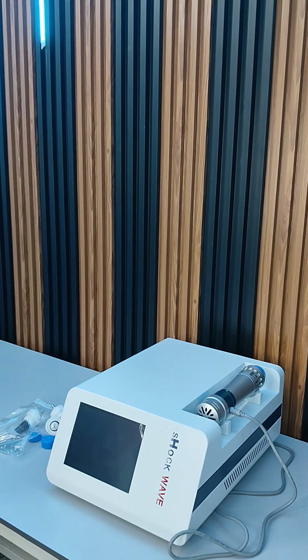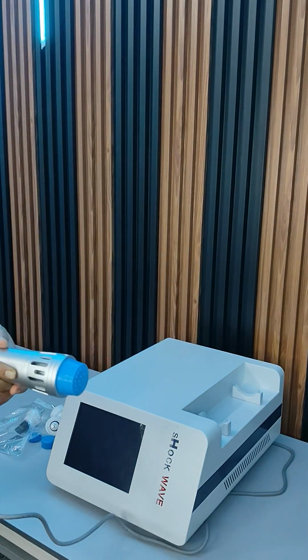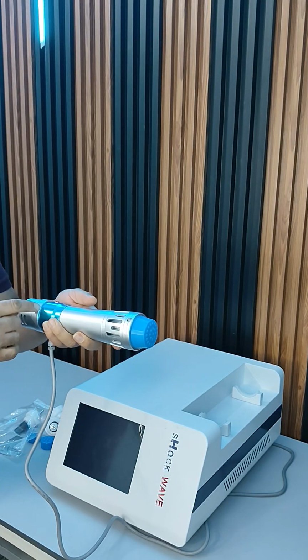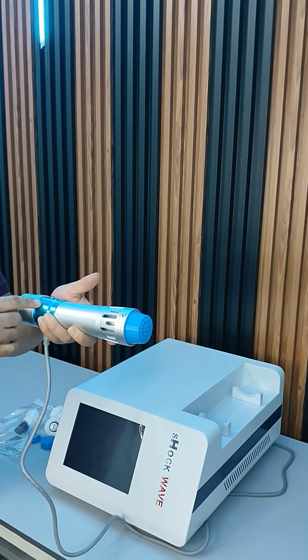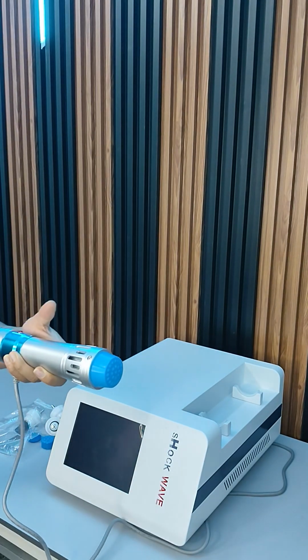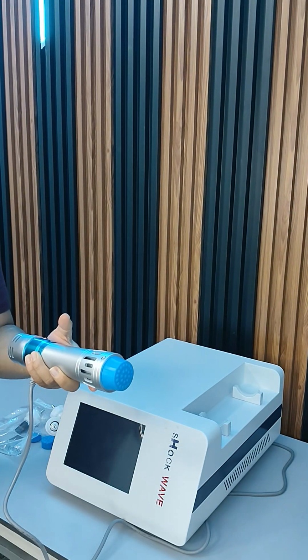Before the demo, I will tell you the difference between electromagnetic and pneumatic. If you take that probe or applicator, there is a bullet inside. That bullet travels from one end to another and strikes and generates the shock wave. That shock wave is used for therapeutic purposes.